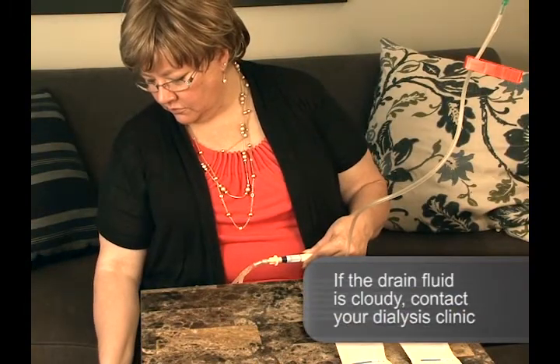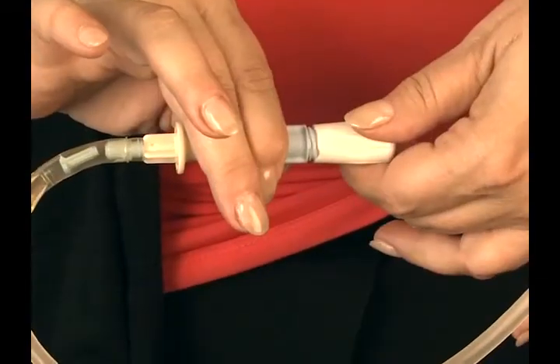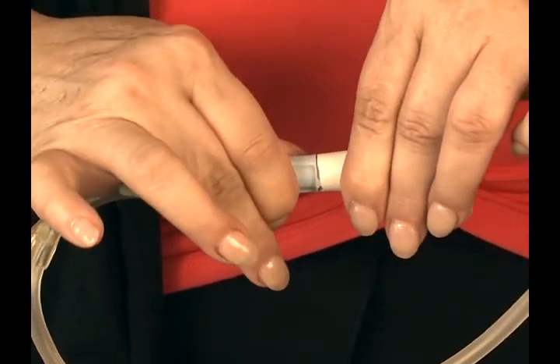If the drain fluid is cloudy, contact your dialysis clinic immediately. When drainage is complete, close your transfer set.